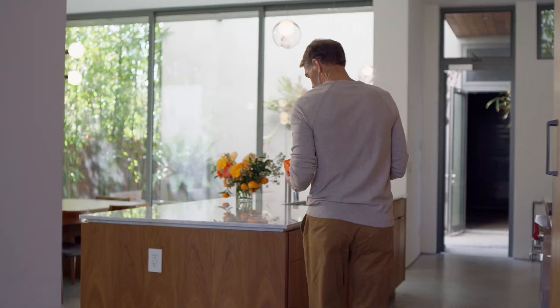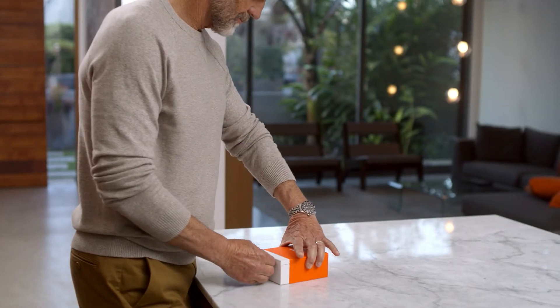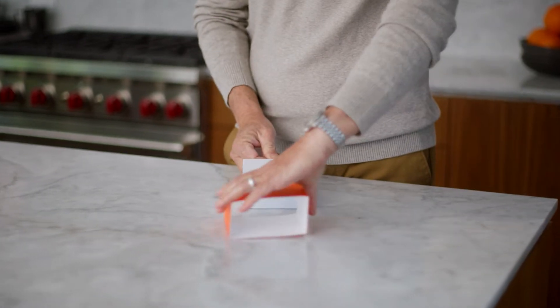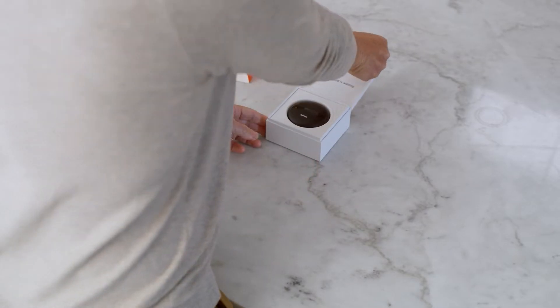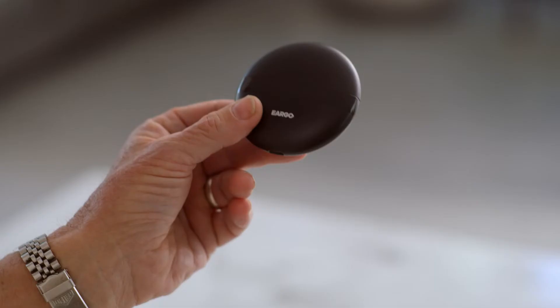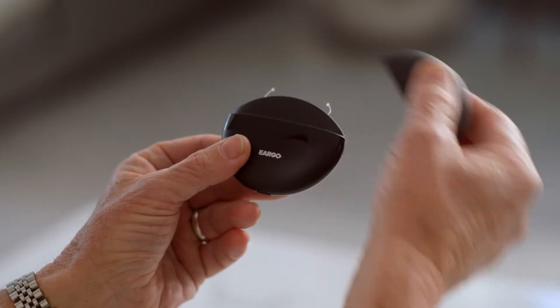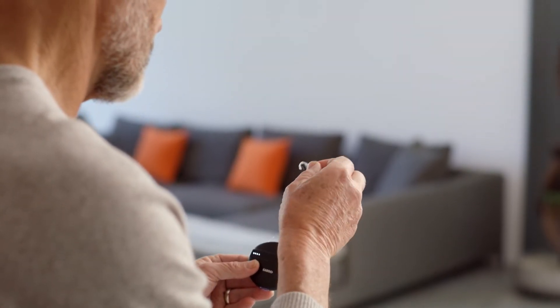From time to time, it will be necessary to replace the microphone cap on your device with a fresh one. On average, the mic cap will need to be changed about every two months, but your mileage may vary. A good rule of thumb is that if the sound quality coming from your Eargo device has changed or diminished, replace the mic cap.